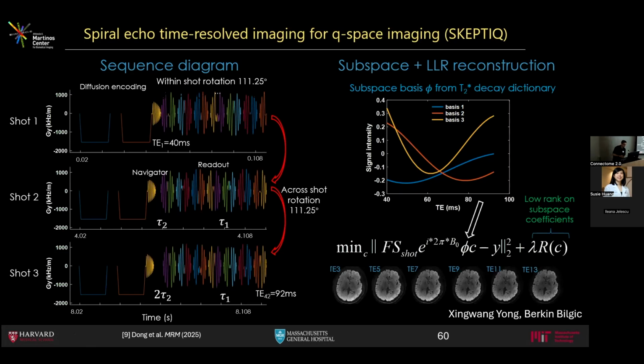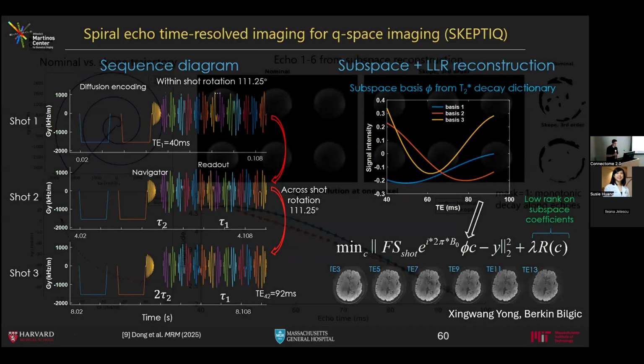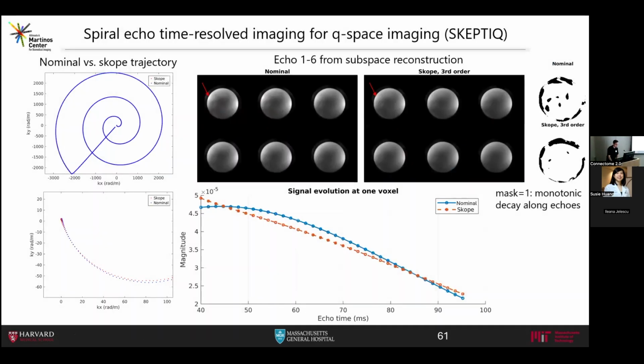With a spiral, you have the ability to acquire, in a single echo, the center as well as the periphery of k-space. And as you rotate your spiral, you can get more and more echoes and then introduce various shots to get something around 50 echoes. These are some preliminary measurements showing how the SCOPE system is able to get more appreciable monotonic decay in comparison to just utilizing non-uniform FFT. And this is also outlined in the mask as shown here.